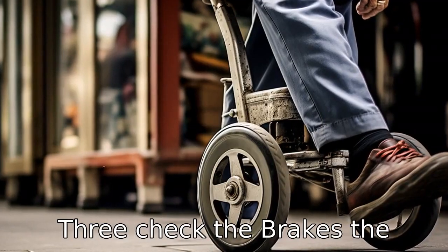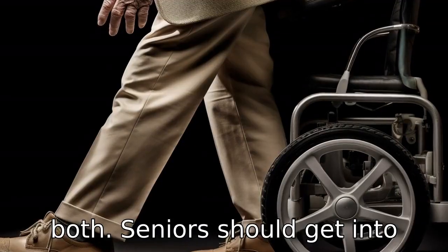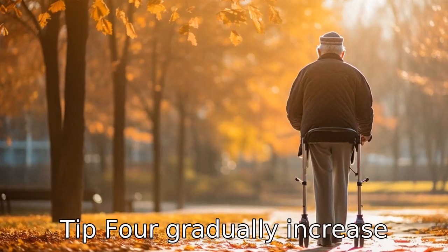Tip 3: Check the brakes. The upright walker may have hand brakes, push-down brakes, or both. Seniors should get into the habit of constantly checking if their brakes are working properly before they start using the walker to prevent falls.